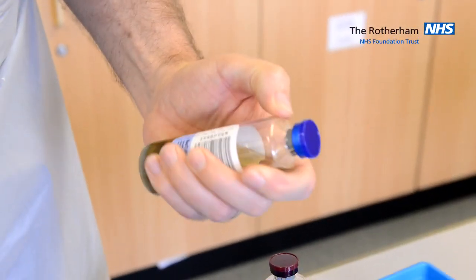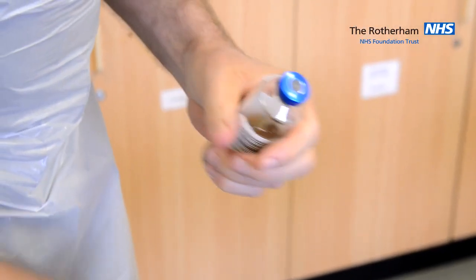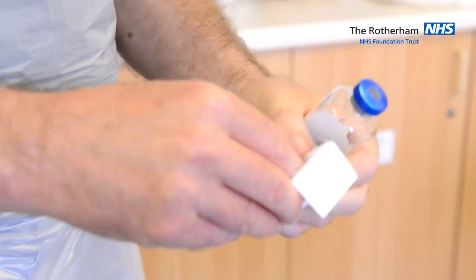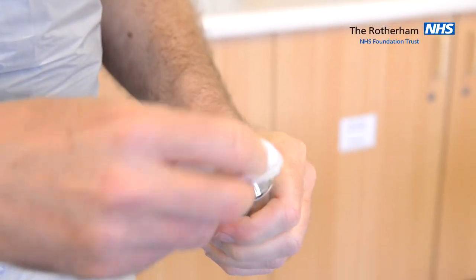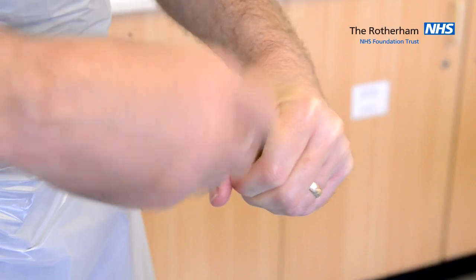Pick up your blood culture bottle and remove the top. Use the chlorhexidine alcohol swab and clean the bottle top for 15 seconds.